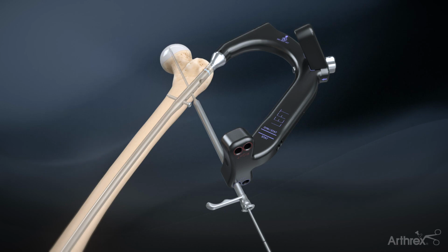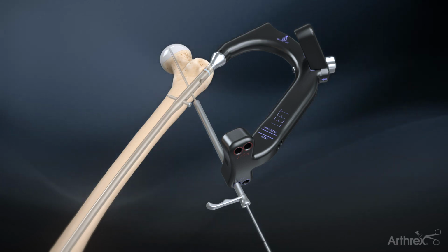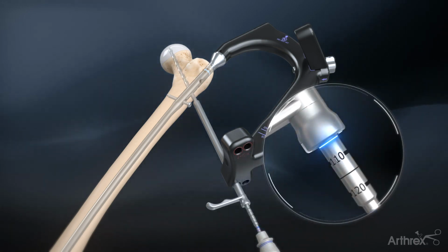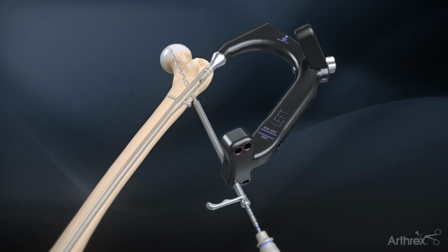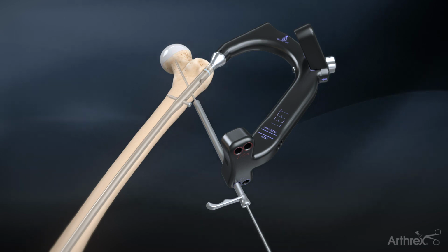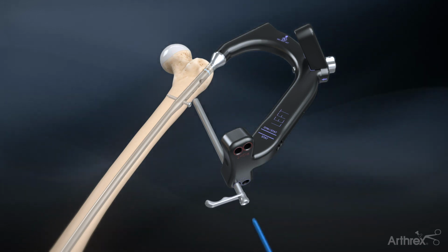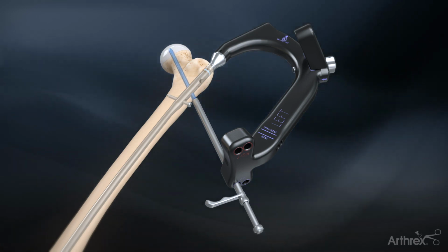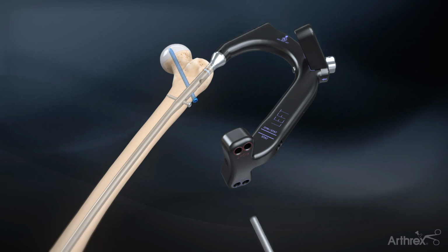Remove the pin guide and drill using the 5.5 mm calibrated cannulated drill over the guide pin to the appropriate depth by using the calibration marks on the drill. Remove the guide pin and insert the 6.5 mm fully threaded cancellous screw assembled on the captured hex driver until the black laser line on the driver is flush with the end of the sheath. Once the screw is fully inserted, remove the screw sheath.